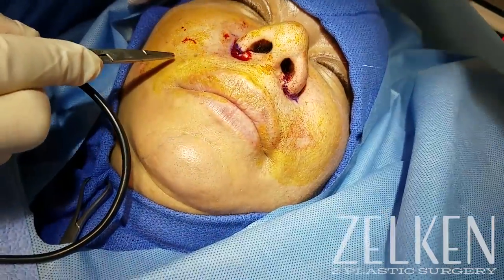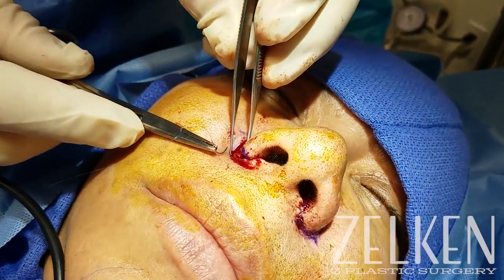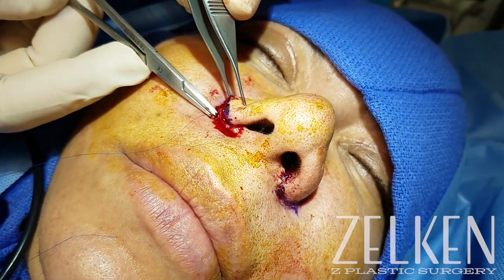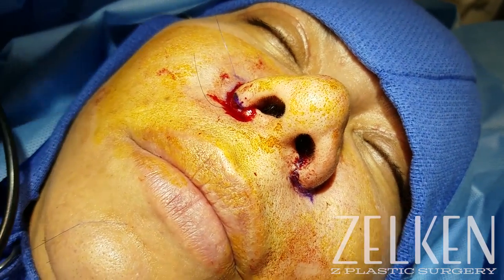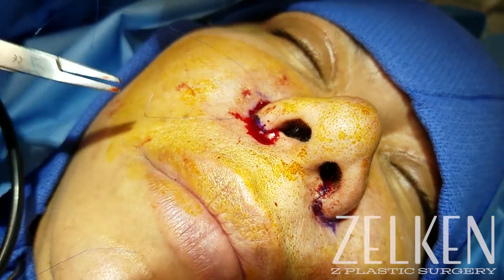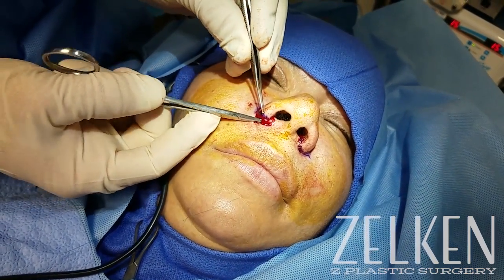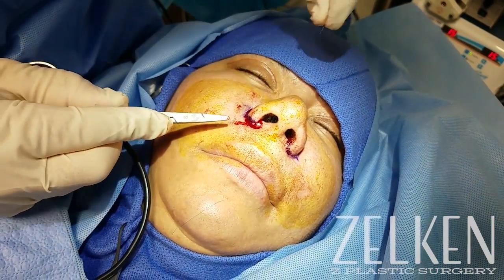I'm going to fast forward through the remainder of the closure, but again it's really important that you understand that we bisect. I placed the alar or nostril sill closure first, which is the key of the closure, and I really take an eye and make sure that I've created a symmetric result. Then I bisect the difference between that suture and the cephalic edge, and then continue to bisect repeatedly. I probably placed about 10 stitches per side. Even though this may seem excessive, I do try to avoid the use of deep stitches for the sake of preventing additional inflammation, spitting stitches, and the possibility of a suture abscess in this sebaceous tissue.